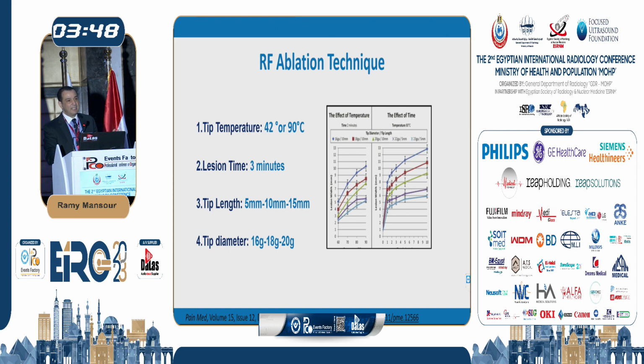And this graph is just not to get confused, but the whole idea of this graph is that the radiologist or physician that uses ablation has the option, and they don't know whether to put the ablation for 1 minute, 2 minutes, 3 minutes, 6 minutes, or 10 minutes. There is no agreed time for that. However, this is just to show you that time is not always the best thing. It's the size of the needle.